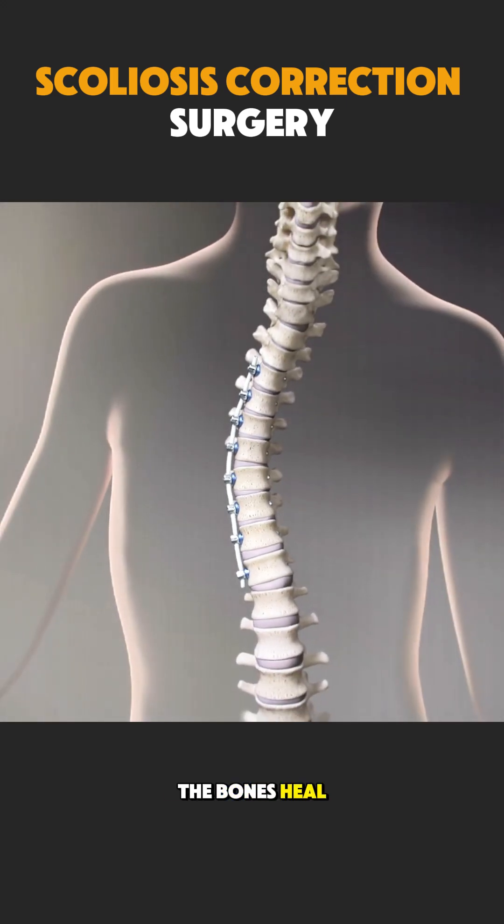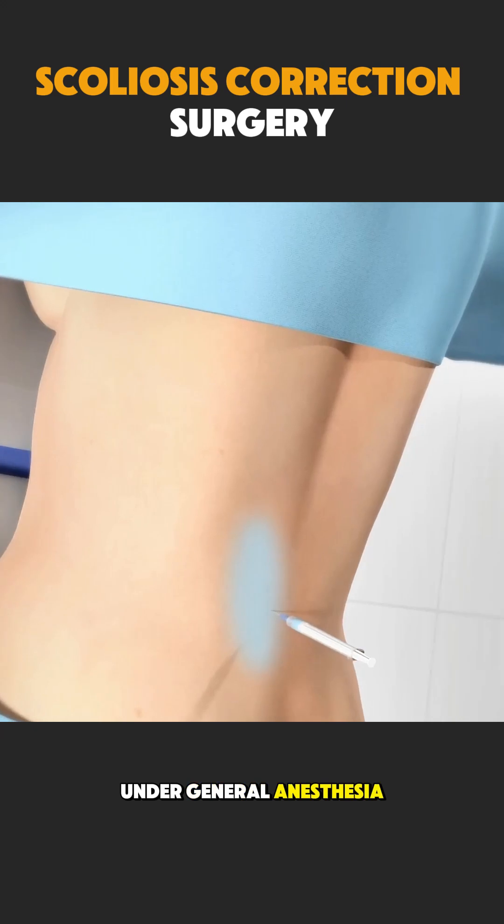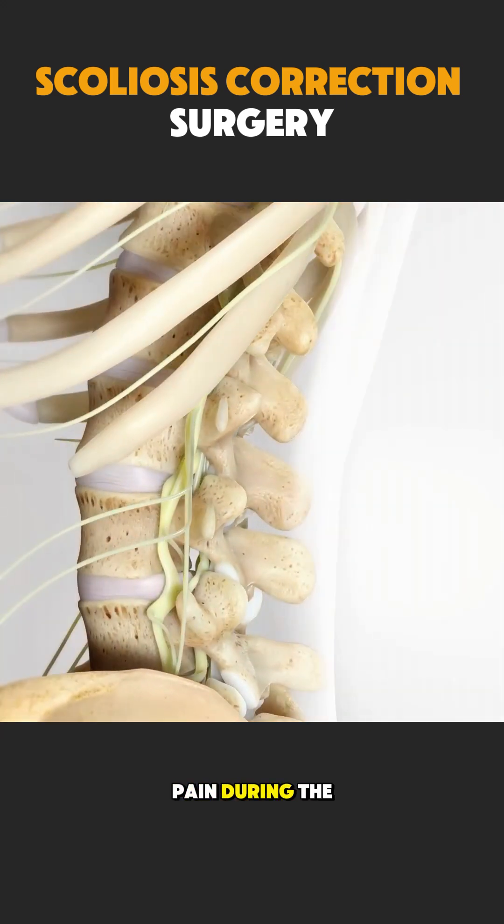Over time, the bones heal and fuse around this corrected shape. The patient is under general anesthesia and feels no pain during the procedure.